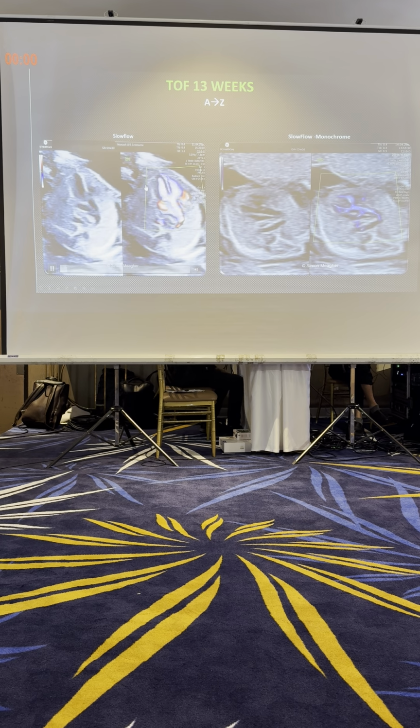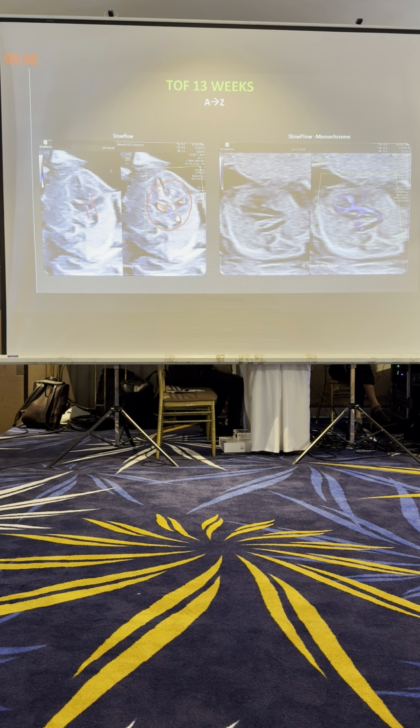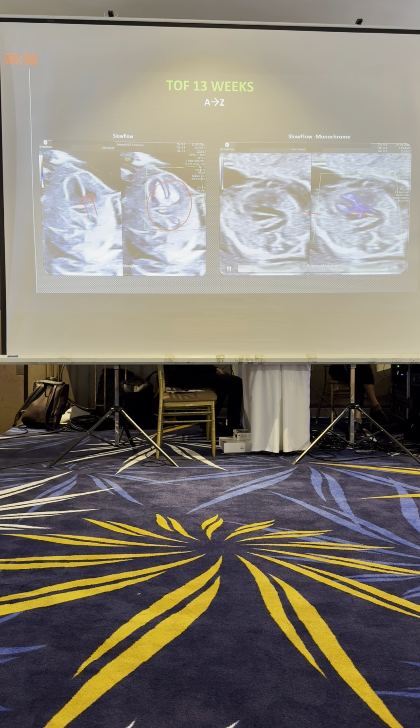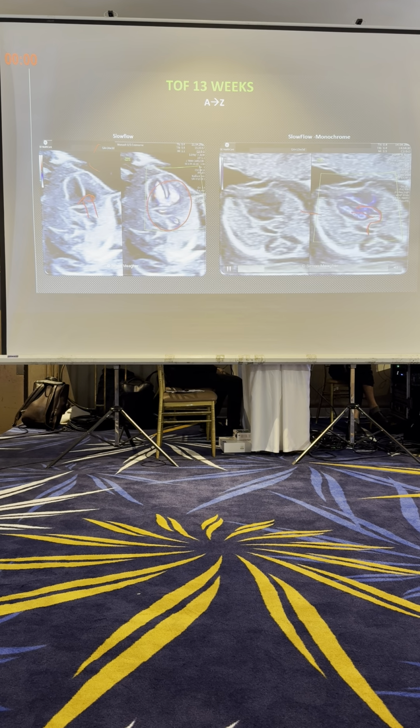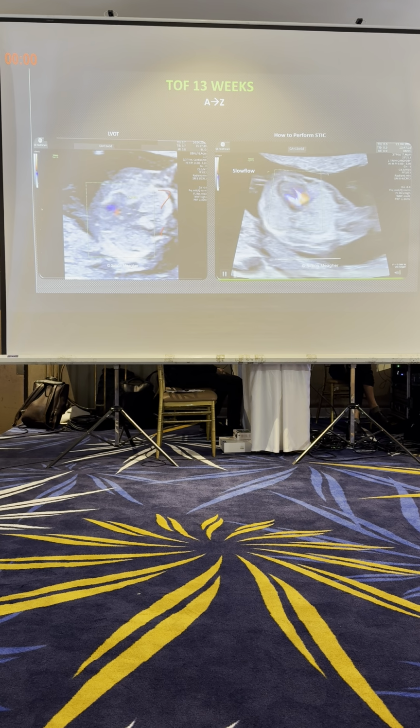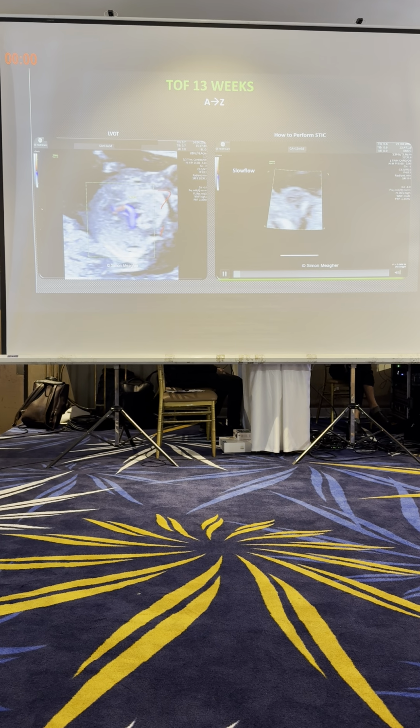I then use slow flow, and I use the 5-chamber view. I'm not screening anymore, I'm doing a dedicated fetal echo. Using slow flow technology with balanced set low, I can see the aorta sitting astride the interventricular septum. And then I use slow flow monochrome, not color, because I don't want directional information. I see that this is the descending aorta, and now I see the question mark sign. So all these markers are coming together in this baby. I then look at power Doppler, I see the question mark in the power Doppler, and on slow flow I see the trouser leg appearance, and then I do a STIC.